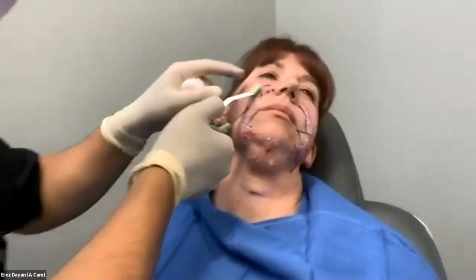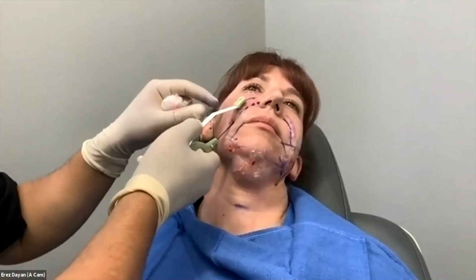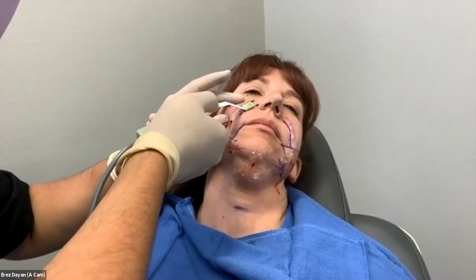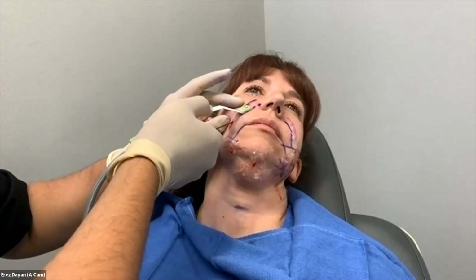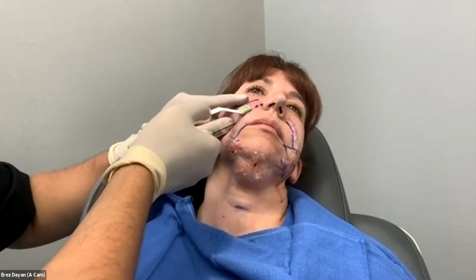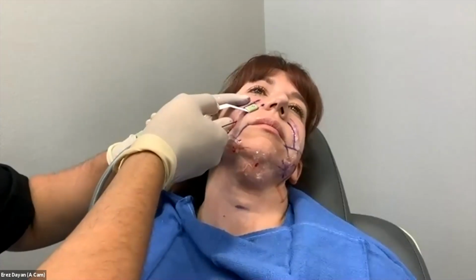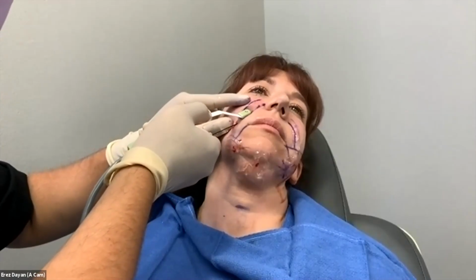Have you put your chin down just a little bit. So again, this is a place where you can become superficial medially because you're coming over the curved maxilla. So you just want to kind of cantilever down. You feel any of that? So you heat up these areas very quickly with the Accutite. It's very efficient. Again, stay away from the entry port, about 1 centimeter. So these Accutite treatments are extremely fast. Don't expect to hang out here very long. See how fast we reach target temperature? It's a small area of tissue.